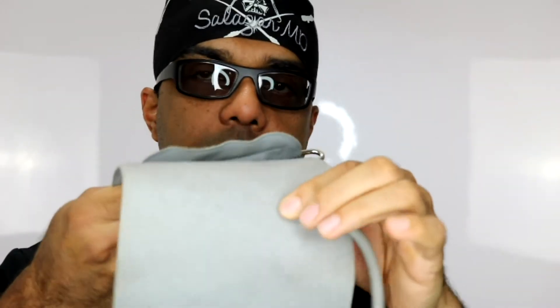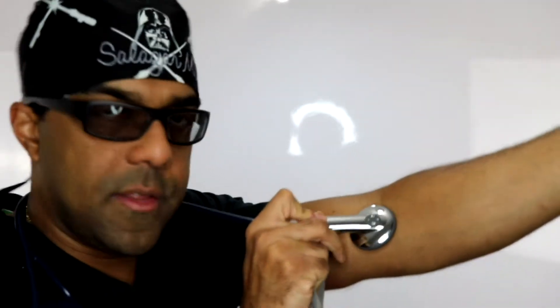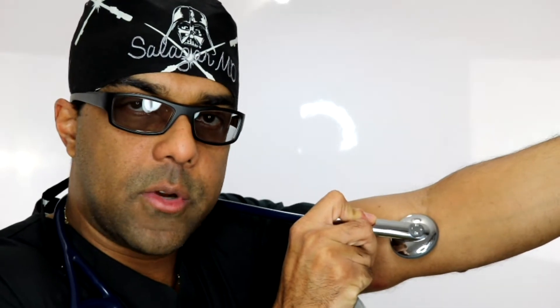With electronic devices for home use, you don't have to listen with a stethoscope yourself — the machine does it. But what you have to realize is that these cuffs also have a built-in bell or diaphragm. If you feel around to the origin of the holes you'll feel a disc in there — that's the machine equivalent of a stethoscope. You're trying to get that in the same position your doctor places the stethoscope on your brachial artery, down here — not up higher where muscle gets in the way.